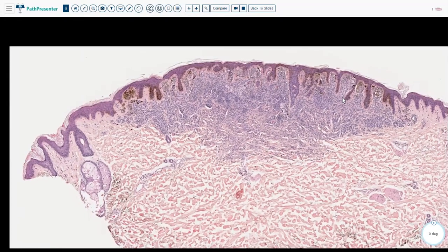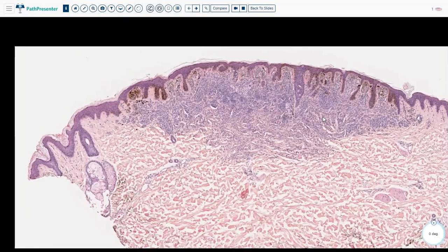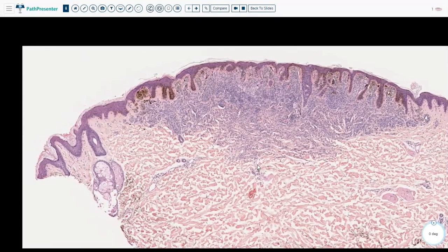First of all, the most important aspect in any malignant or benign entity is to note the symmetry of a lesion. That's important in any neoplastic condition in the skin, not just melanocytic. What we see here is very good symmetry. From the left and the right of the lesion, it's quite symmetric. They look like each other on both sides.